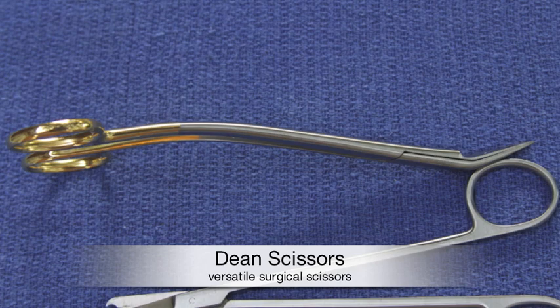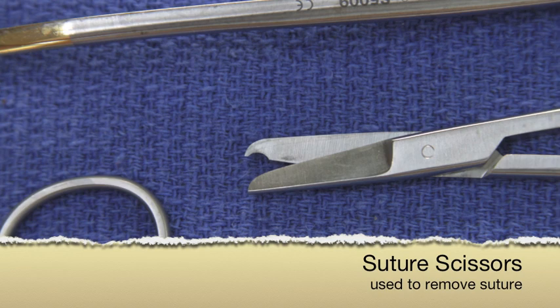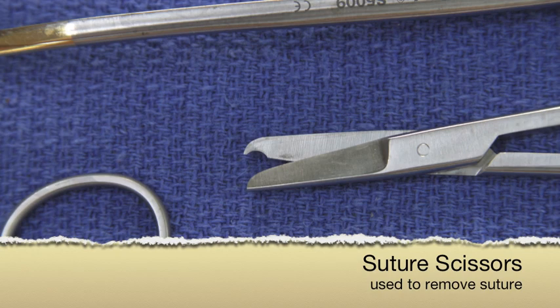With regard to suture scissors, they are immediately noticeable because they have a notch at the tip. This notch is there to facilitate the removal of suture.